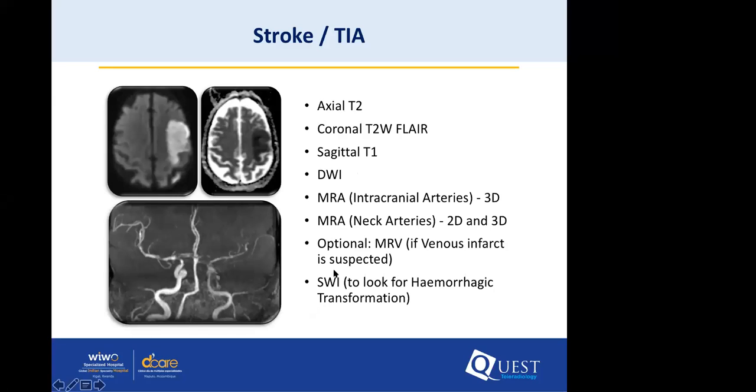Okay, so we move on to the next one. Very important. This is extremely important. Stroke. Stroke is significantly increasing across the world, and we are seeing more and more younger patients involved with stroke. And second thing, management of stroke has significantly changed. From doing nothing to thrombolysis, now we are doing direct thromboembolectomy, i.e. going through the carotid vessel straight into the cerebral arteries and plucking out the thrombus, so that we reperfuse the brain as fast as possible, similar to heart attacks, stroke attacks.